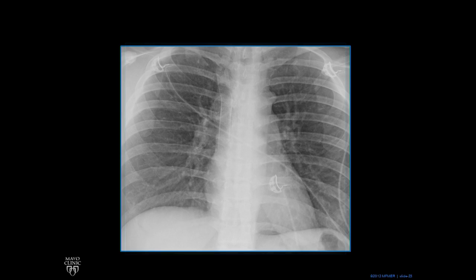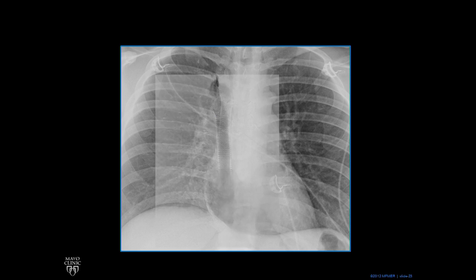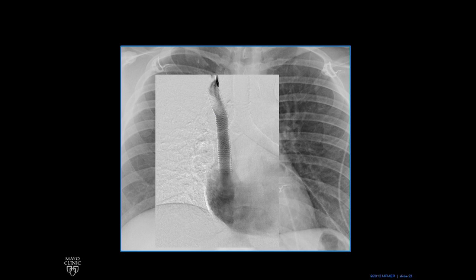So what happened? A stent was placed to open up the superior vena cava and relieve the obstruction. The person was getting plethora in their face and extremities. If we overlay an angiogram, you can see that this stent really is the SVC — you can even see the trachea behind it — and it drains into the right atrium, which makes that lower part of the right heart border, which we'll get to later.